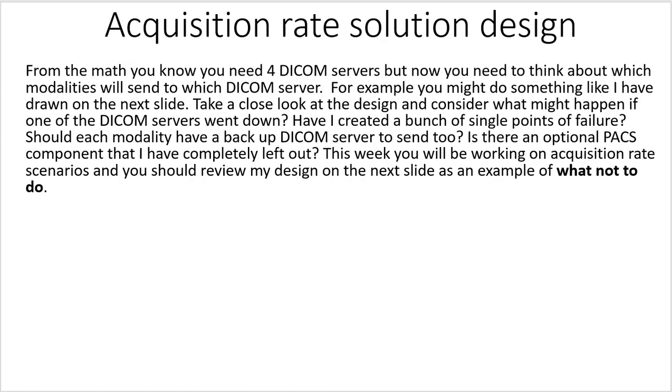From the math, you know you need 4 DICOM servers. But now you need to think about which modalities will send to the DICOM server. For example, you might do something like I've drawn on the next slide. Take a close look at the design and consider what might happen if any one of the DICOM servers went down. Have I created a bunch of single points of failure? Should each modality have a backup DICOM server to send to? Is there an optional PACS component that I have completely left out?